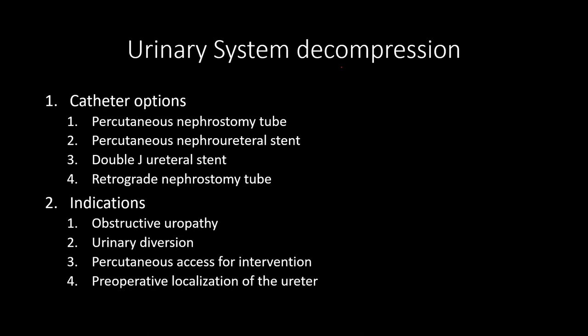So a percutaneous nephrostomy tube is a drainage catheter that we put in through the skin, and the actual pigtail portion of the tube stops in the urinary collecting system. So it's adequate to drain kidneys that can't drain their normal anatomic route into the bladder. Good for treating hydronephrosis, pyonephrosis, all those things.